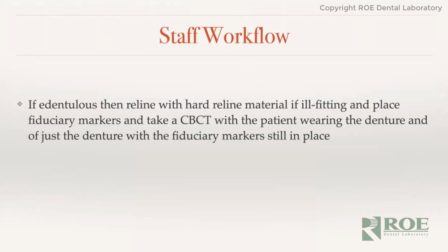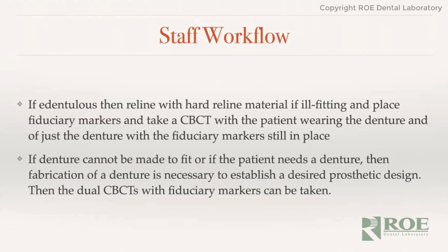Now, again, with this, our staff workflow, if it's an edentulous area, they have to know if we're going to have to reline the denture, that the denture is loose, or if we're going to be able to start taking our CBCT right away with the fiducial markers, or if we have to remake the denture. If we have to make a denture for the patient, that's going to add several different appointments. So you cannot schedule your patient 4 to 5 weeks out. You have to incorporate that into the process. And again, the financial office needs to know that before the patient ever goes back, that we're going to have to make a denture for the patient for this situation. It's very important with our scheduling.